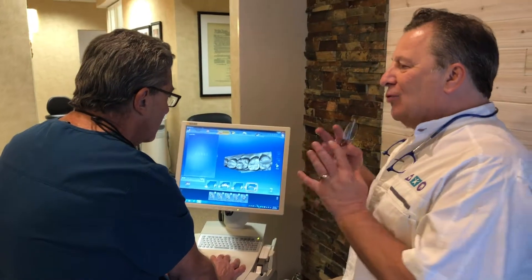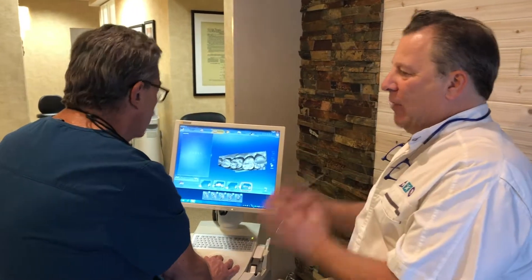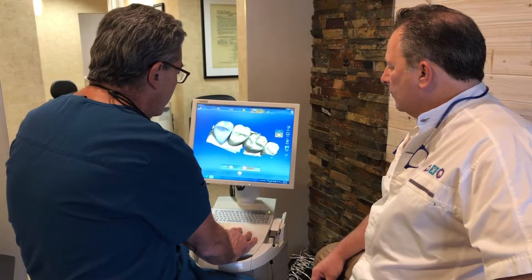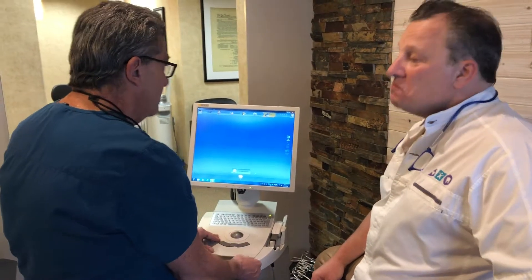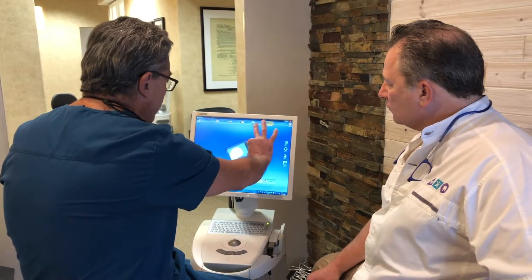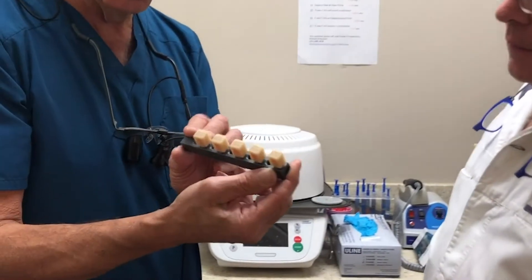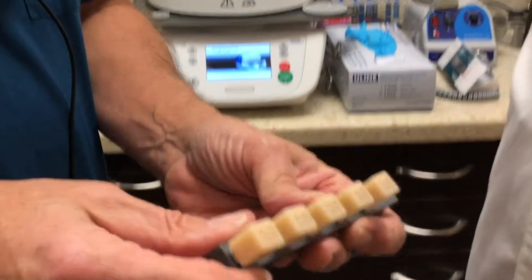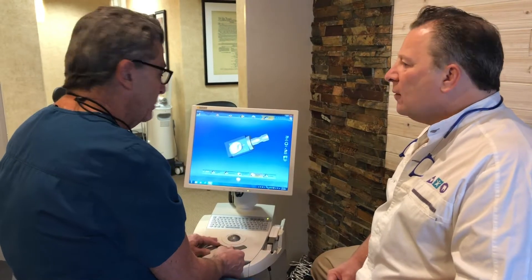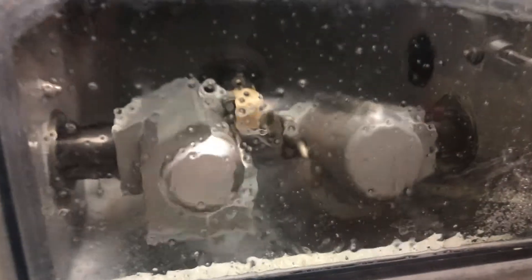You're basically making a virtual duplicate of the person's crown or tooth. When this is done, you send it off to the mill. This gives you what's called a mill preview. The crown is actually made out of a solid block of porcelain or other materials depending on the strength characteristics needed. These blocks come in all different colors so you can match it to the patient's existing color. Then this gets sent off to the milling machine, and it's going to cut an exact duplicate of what you see on screen.